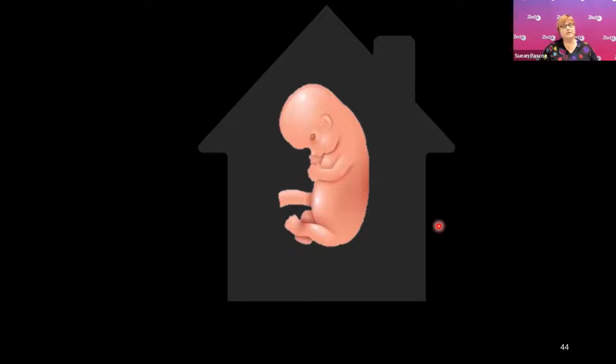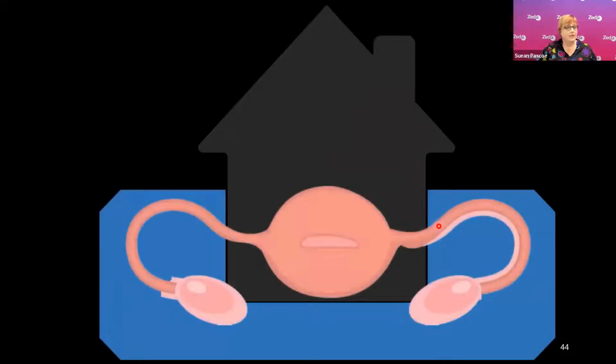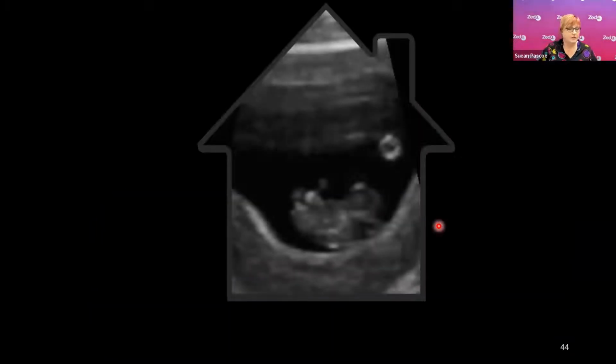And so I think of the uterus as baby's house. And the first thing I'm going to do is look at all of mum's anatomy and look outside baby's house. I then look at baby's house, then the gestation, and then focus on the embryo. So we start by looking outside the house, scouting around in the adnexa. We're looking at the ovaries, the adnexa, and the cervix. Is it open or closed? Then we focus on the uterus and bring our attention more centrally towards baby.